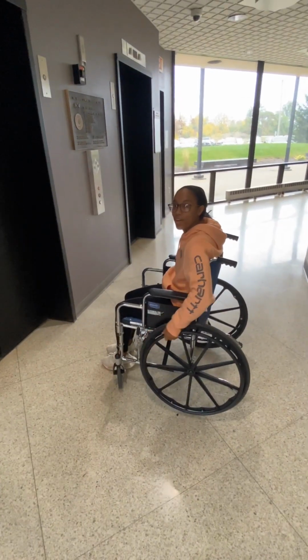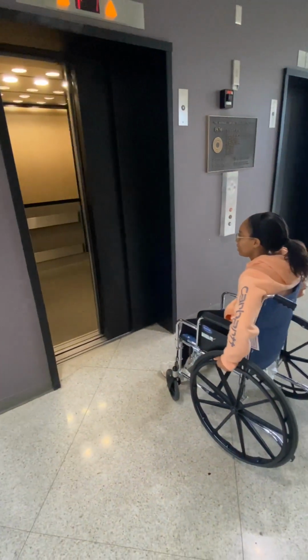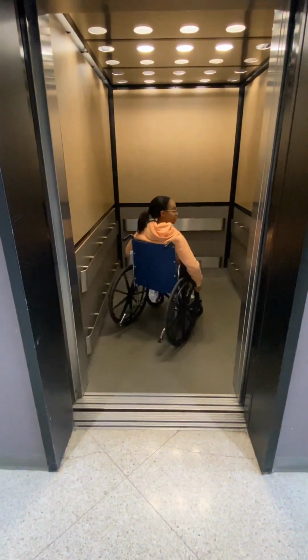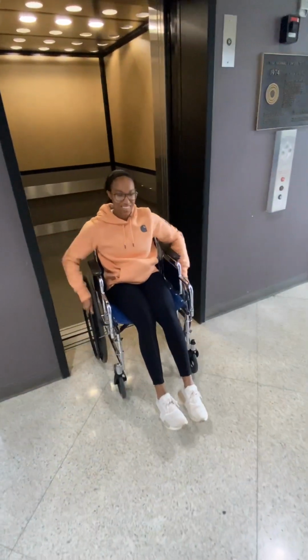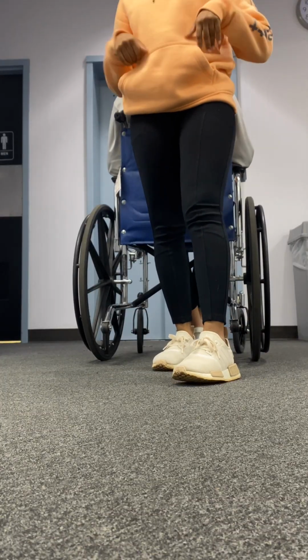Set, go. Alright, so going forward in an elevator, open it up, roll in, turn, so that you can roll right back out afterwards. Assisted going in backwards and coming out forward.